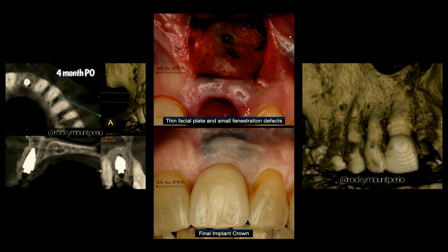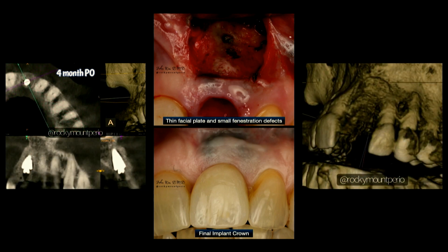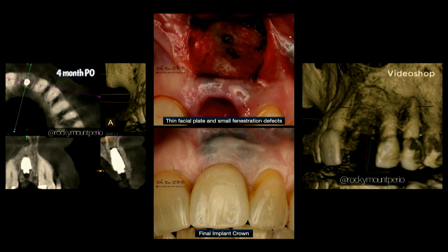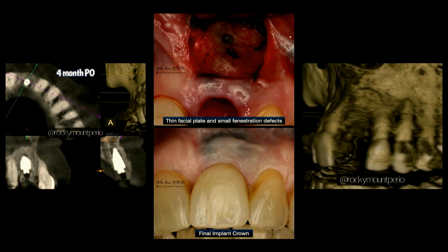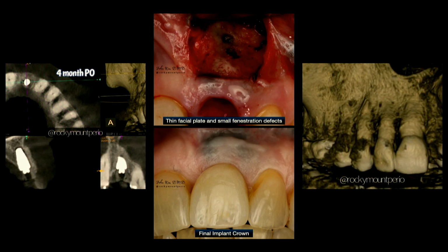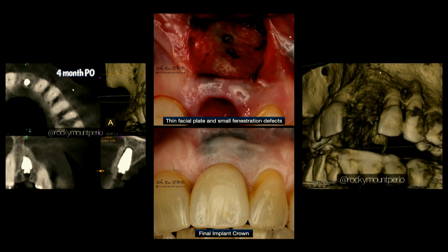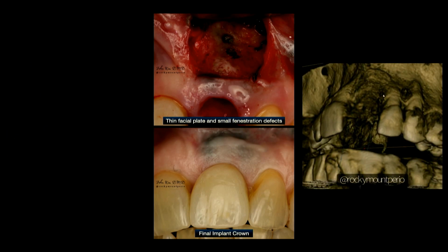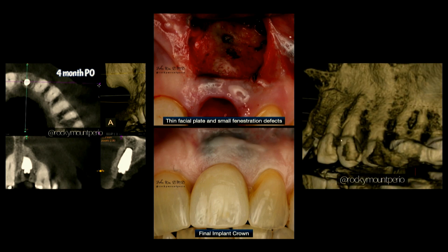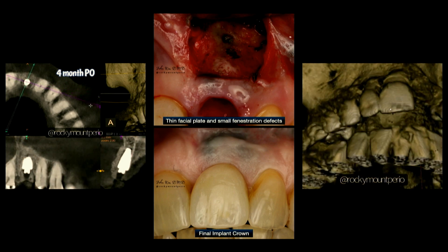And if you remember that GTR case that I showed you earlier, I talked a lot about how BioXclude can have a positive effect on keratinization. It almost looks like a little mini free gingival graft a little bit more apical there. And so, again, predictability in an area where I feel like there's not as good vascularity because this patient had gone through so many surgeries. There's all that foreign material there, more scar tissue, all the reasons for me to want to incorporate biologics when I treat a case like this.